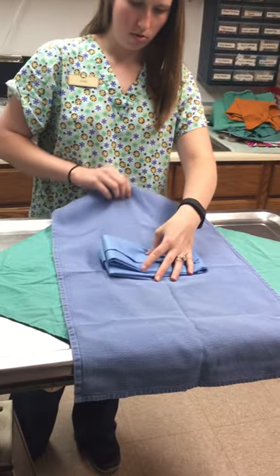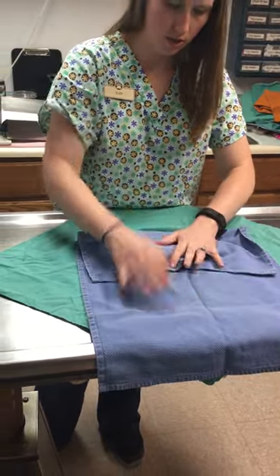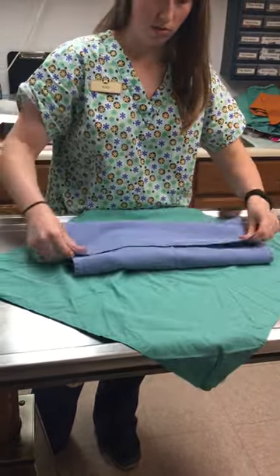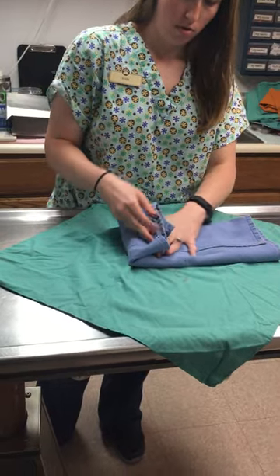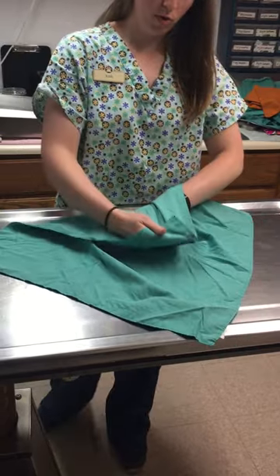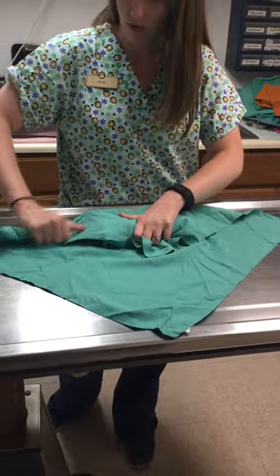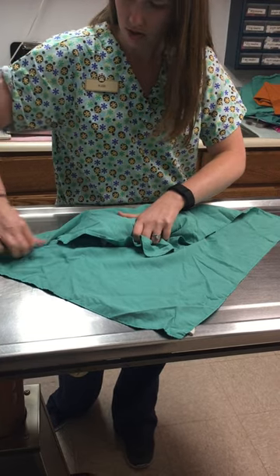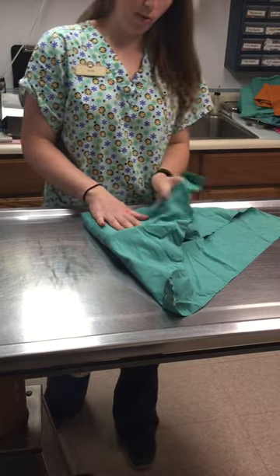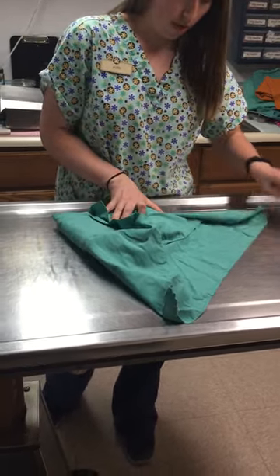I'm going to tuck this in and make sure it's tight and wrapped. You can wrap more than one drape in a pack if you need to. I'm going to flip this corner that comes up and tuck it in under, fold these in and tuck it under. You always want to have the points facing out so that way you can pull them out when you're unwrapping it.